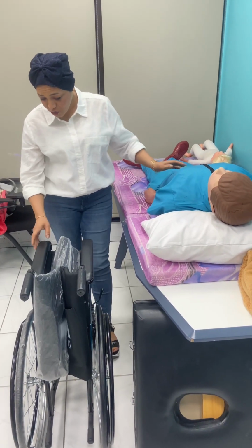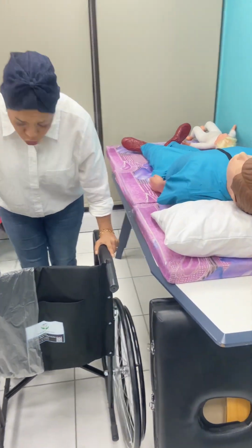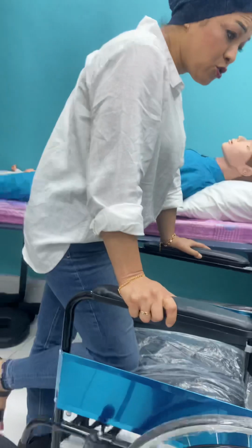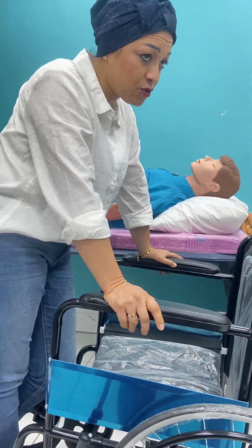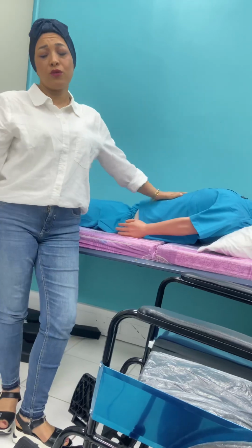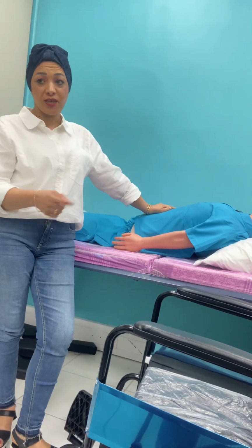First thing I have to do is that I bring my chair. I put it next to the bed. And usually we put it on the side of the strongest leg, because if the patient is going to stand, he's going to lean on the strong leg. So it will help him more, okay? Anyway, it's mentioned on the file what the comorbidities of the patient are. You know what the limitations in movement that he has, so you know which leg is weaker than the other.